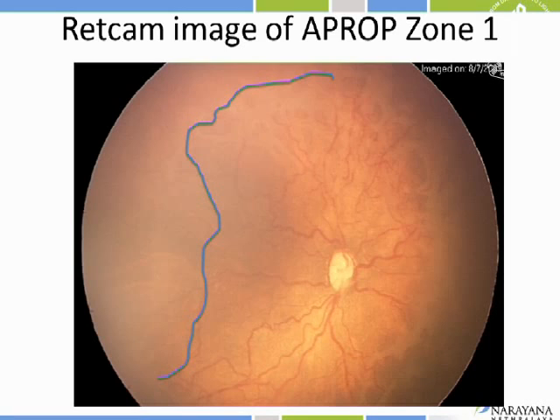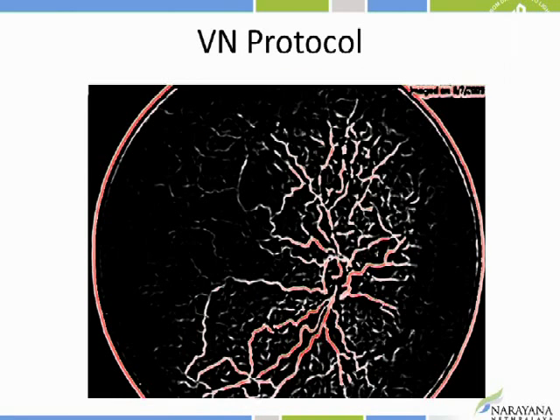of the retina. And what we're trying to look at is by getting this kind of a vesselness protocol, are we able to detect vessels beyond where they are seen with the naked eye? And therefore, maybe we can actually recharacterize or re-diagnose these patients from zone 1 to maybe even posterior zone 2. And we all know what a huge difference that makes in terms of the management decision and the prognostication and even how they do with treatment. As we know, Flynn's group has described what the difference between vasculogenesis and angiogenesis is. So we're trying to see if we can match vessel anatomy picked up this way.